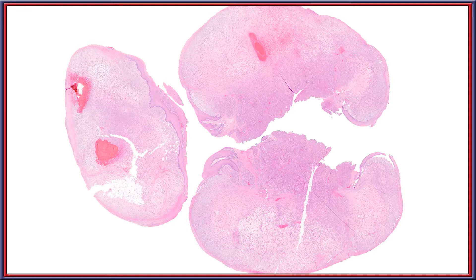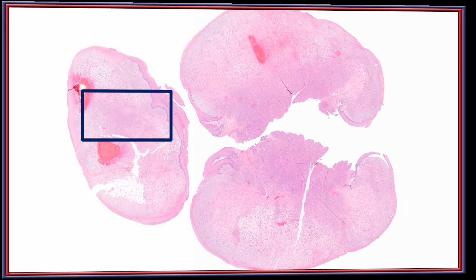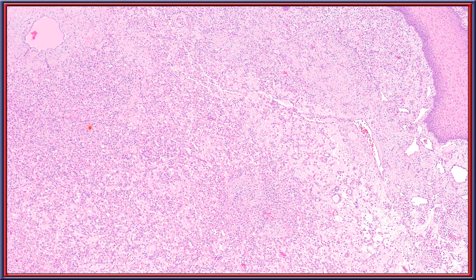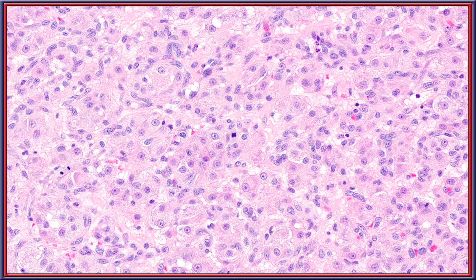Looking at a different area of this same tumor, there are multiple neoplastic cells present in a very myxoid stromal component, and yet still present in a slightly more solid appearance adjacent. On high power, you can tell that there is abundant cytoplasm of these polygonal cells with easily identified mitotic figures.